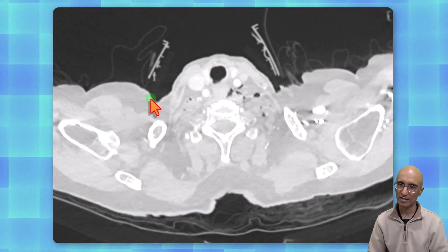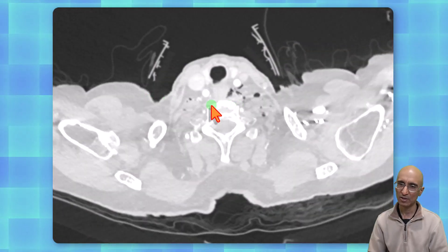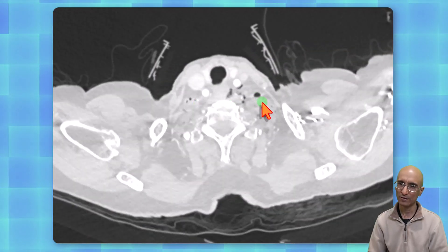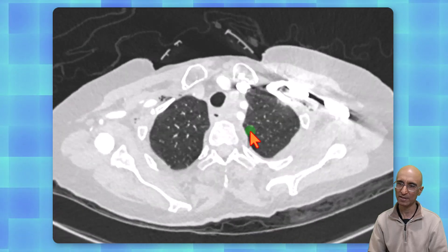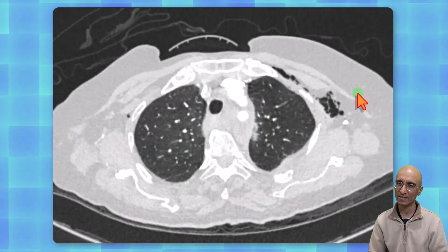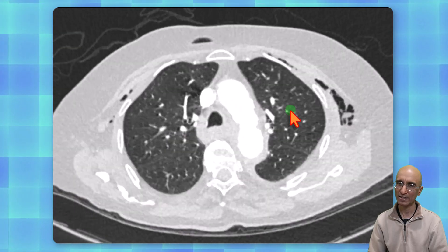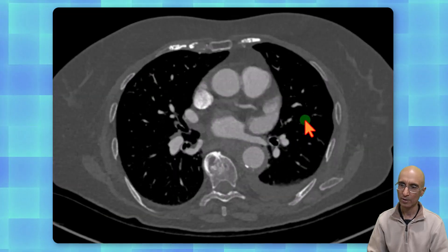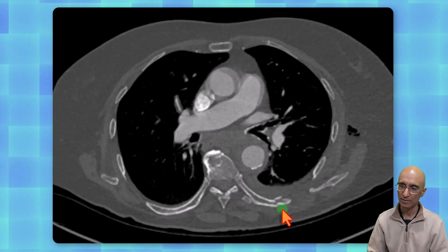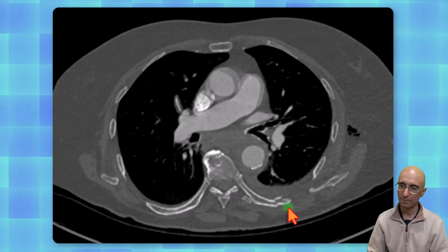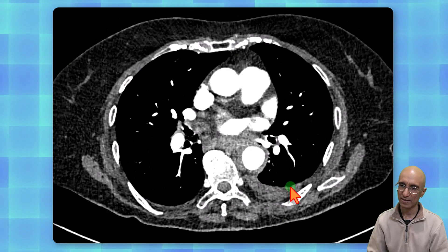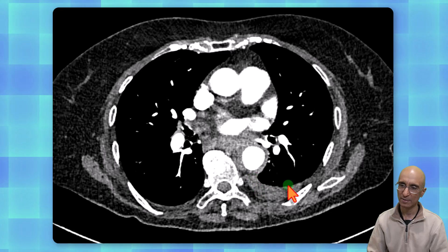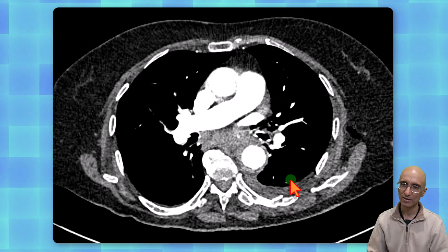On the CT examination on the lung windows, we can see soft tissue emphysema in the neck and in the chest wall bilaterally. On the bone window settings, we can see multiple left-sided rib fractures with associated hemothorax.